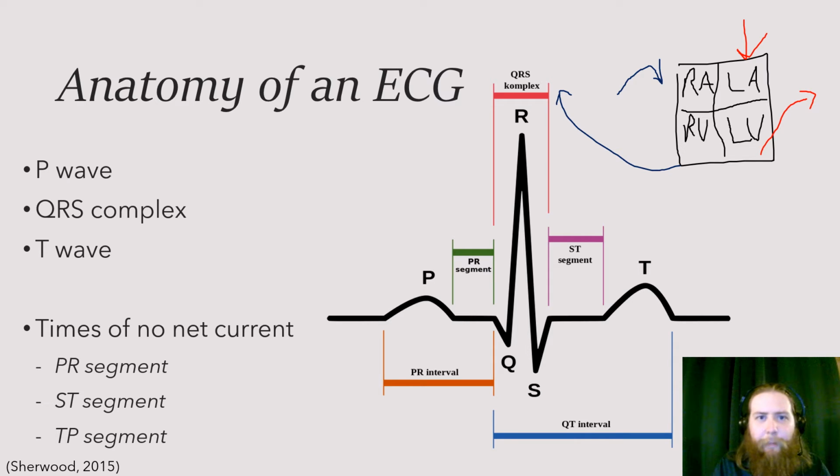So first, we see the P wave. We see those atria contracting and kind of squishing that blood. We don't see the sinoatrial node, which is up here, because there's not enough electrical current that's reaching the skin. That's one of those considerations that we were talking about. It happens.